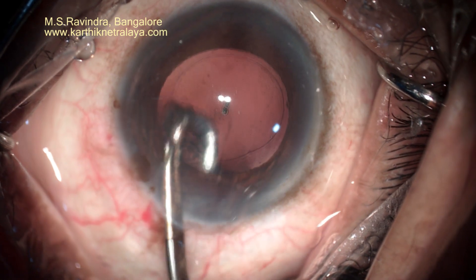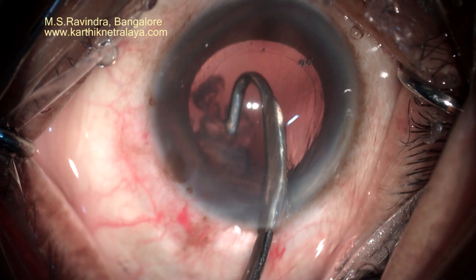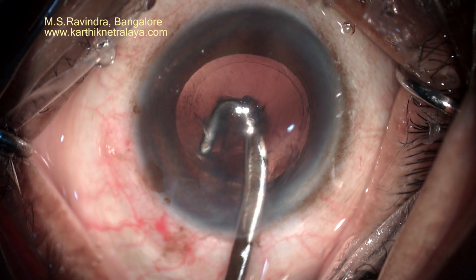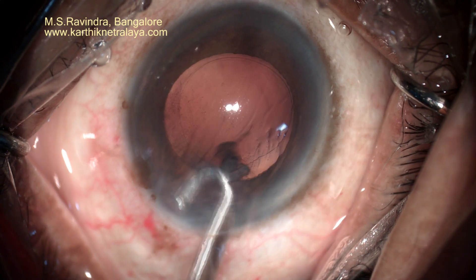It is a direct tunnel without raising a conjunctival flap, so it heals extremely well because a strip of conjunctiva is taken along with the limbus and the cornea in the tunnel formation. The J-shaped cannula to the left side completes the cortical aspiration.